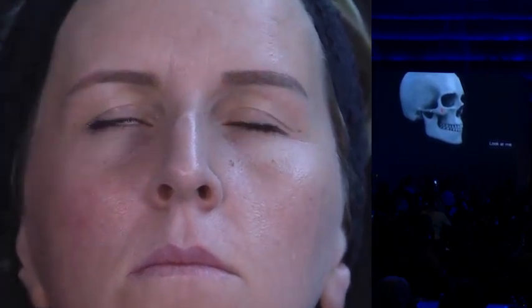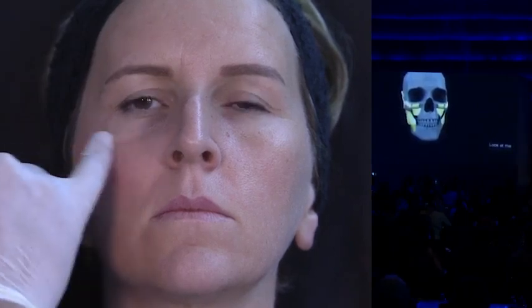That's the projection. Right. Can you show now the fat pads that we are restoring with our volumization, the malar, deep malar fat pad, Frank? Now you see the fat pads. In a second, we have some lagging. Right, so there are the fat pads. We are restoring that fat pad with our volume, Restylane Volume.